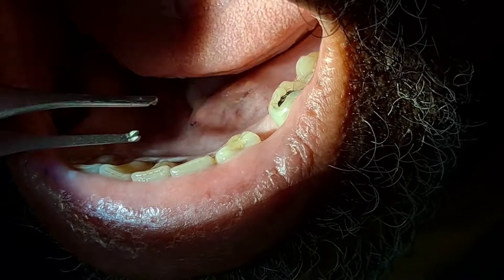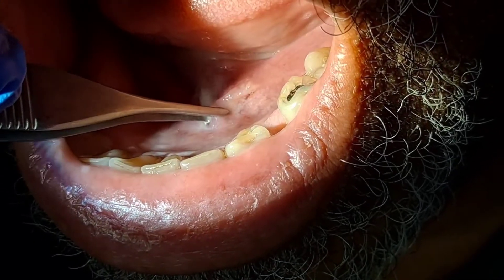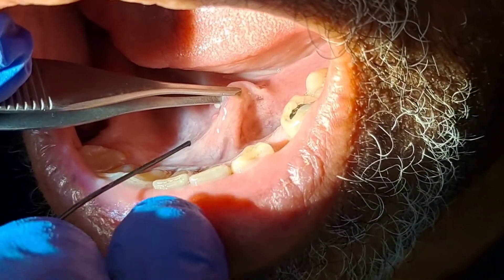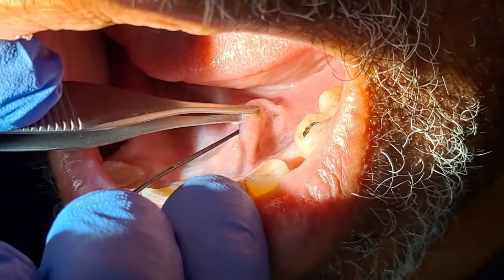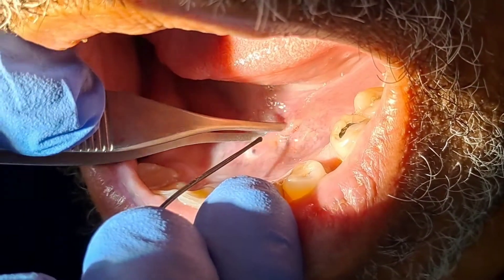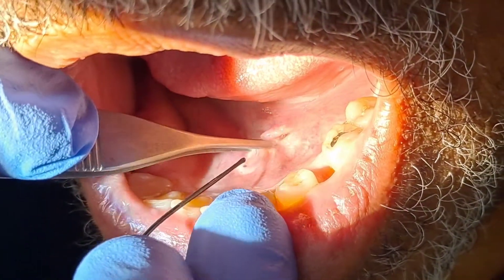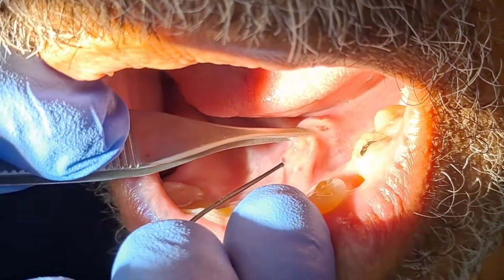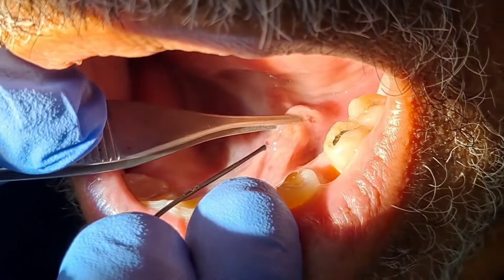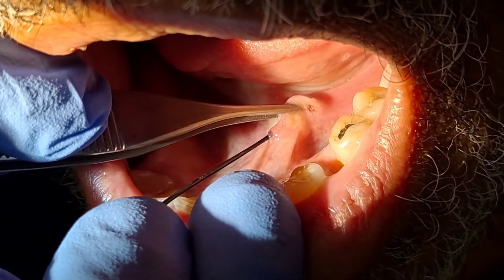Here we explain how to dilate and extract a sub-mandibular stone out of the sub-mandibular duct, or Wharton's duct. First, we start by trying to dilate the duct using a lacrimal probe, starting with a double-zero first.